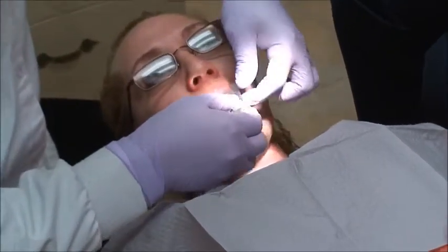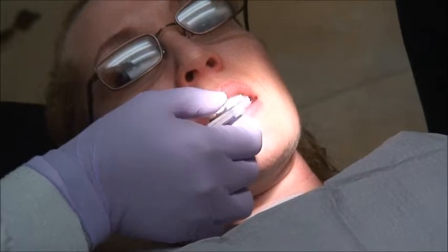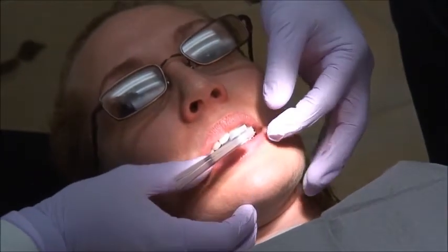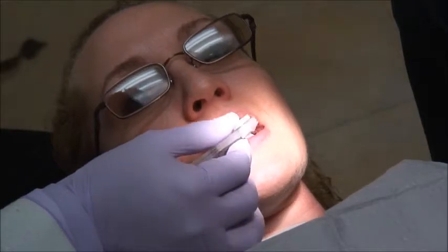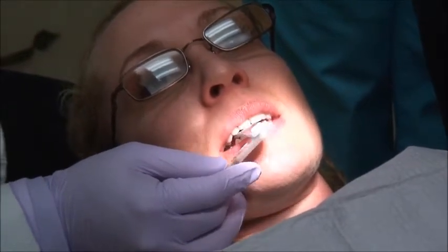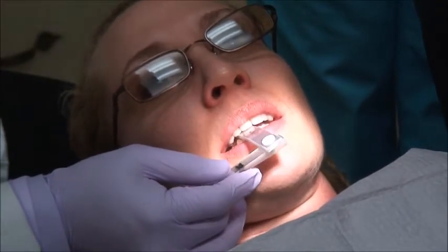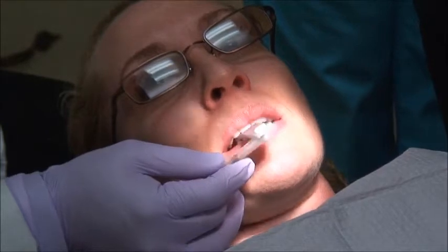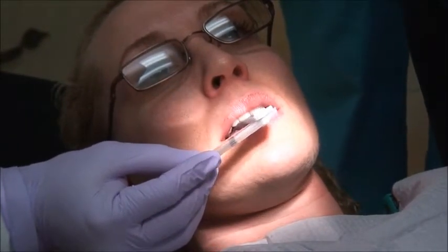And now you're going to bite. Now you're going to do the same thing that the patient will do — this forward back squeeze. Forward back squeeze, back squeeze, forward back squeeze, forward back squeeze, forward back squeeze.